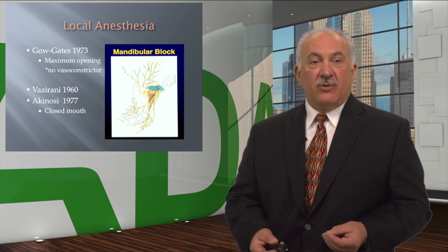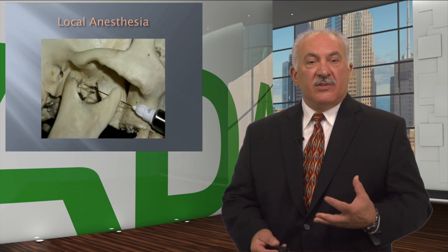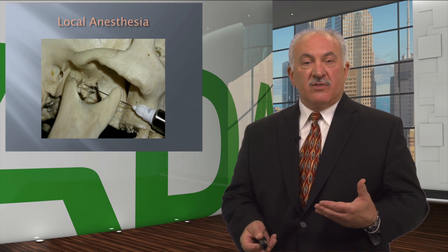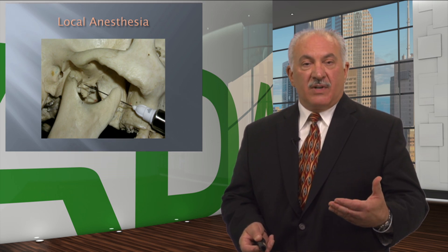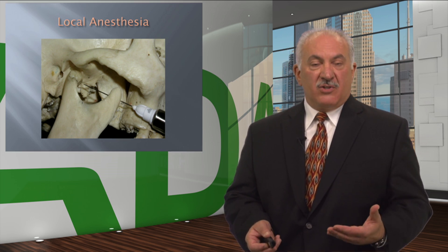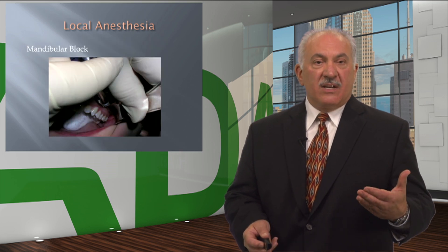I am proposing you consider a hybrid. This is a dry human skull using a 25-gauge long needle. Anatomically, you can see the medial pole of the condyle very close to the beveled end of the 25-gauge long. There's no bone that you contact. You are parallel and just above the mucogingival junction of the maxillary gingiva, and you take the hub as far back to the third molar area, you aspirate, and then you slowly inject.